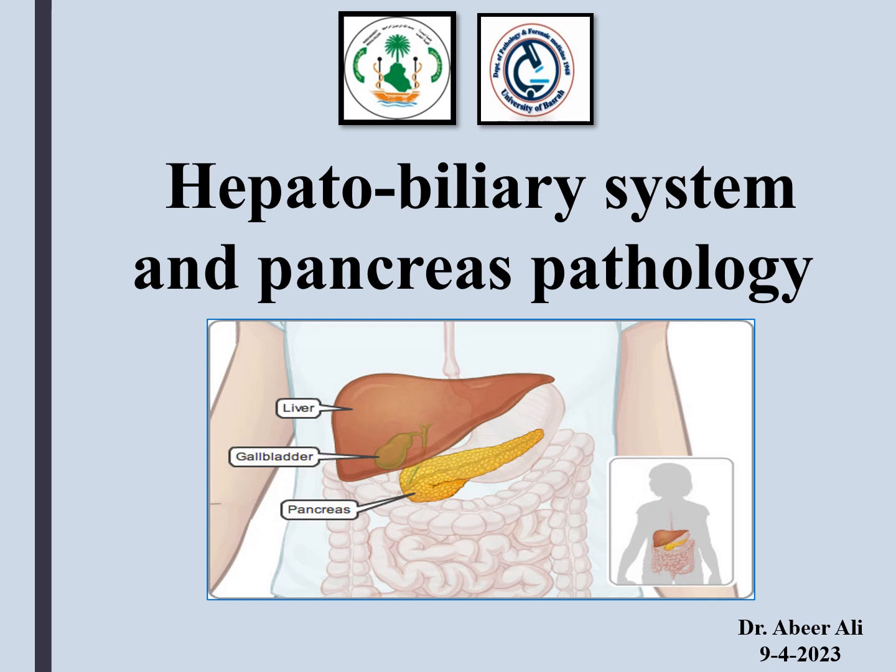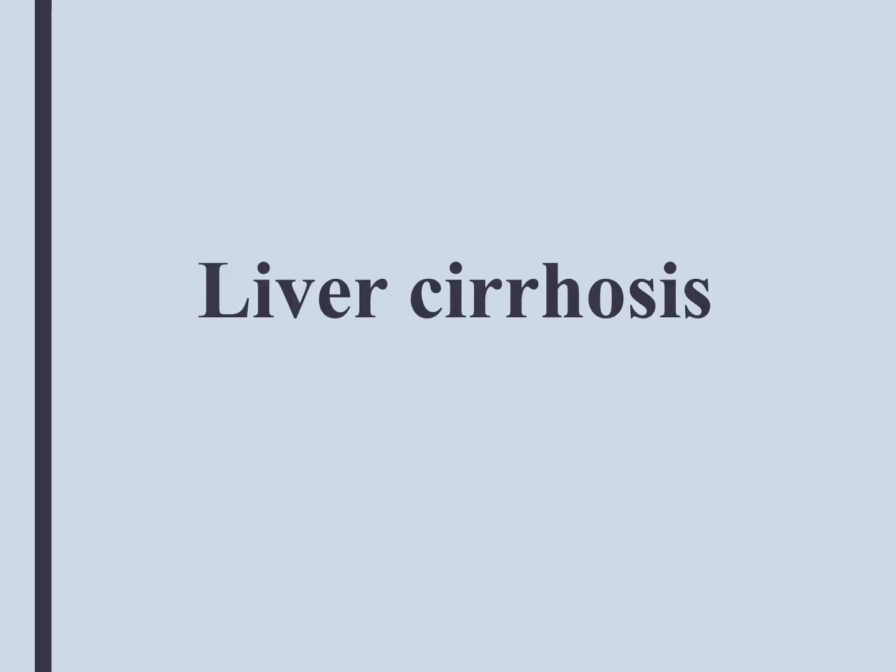Dear students, I'm Dr. Abir Ali, and I would like to present to you a practical lesson regarding the pathology of the hepatobiliary system and pancreas. The first topic is liver cirrhosis.